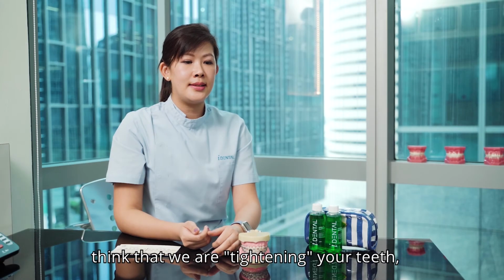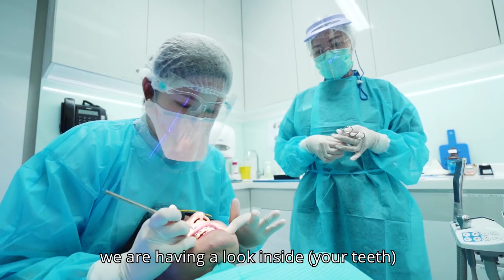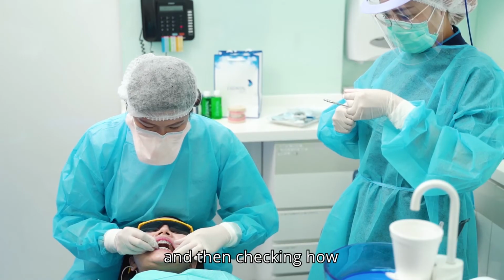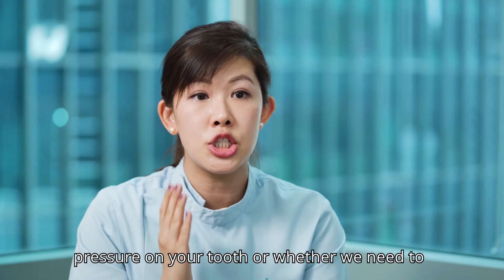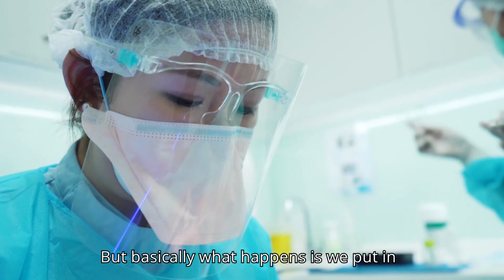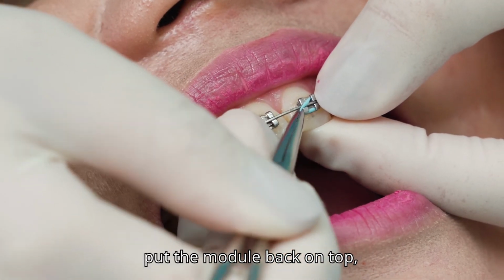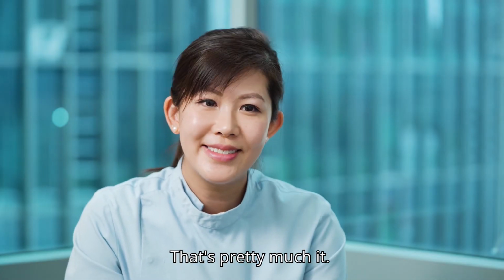So a lot of patients think that we're tightening your teeth. Technically, we're not tightening your teeth. We're having a look inside, removing your modules one by one first, maybe removing your arch wire, and then checking how your teeth have been progressing, whether we're applying enough pressure on your tooth or whether we need to change the bracket a little bit. But basically what happens is we put in a new wire or maybe the same wire, put a little module back on top, cut the ends off, and that's pretty much it.